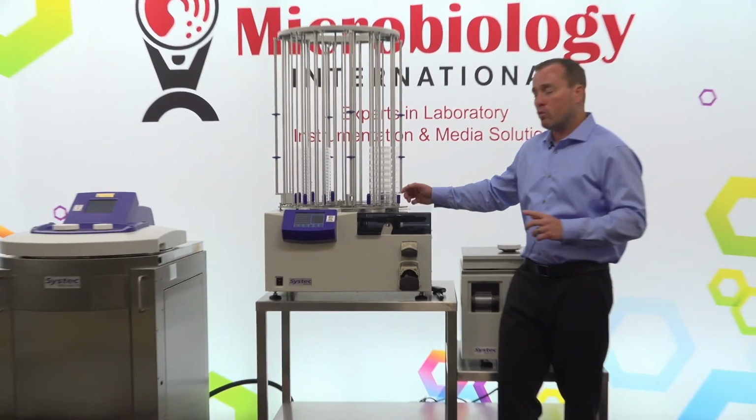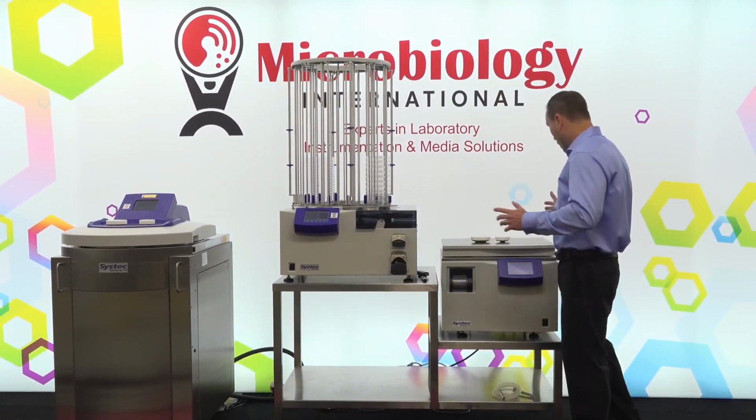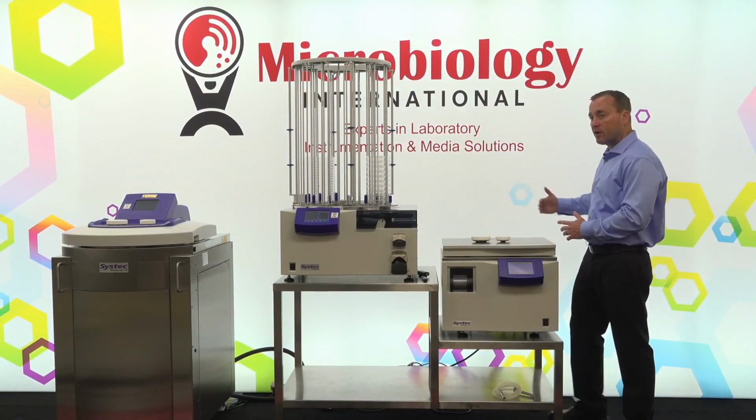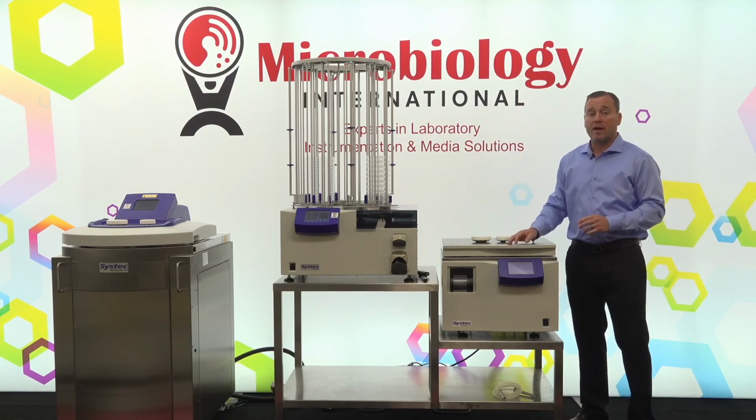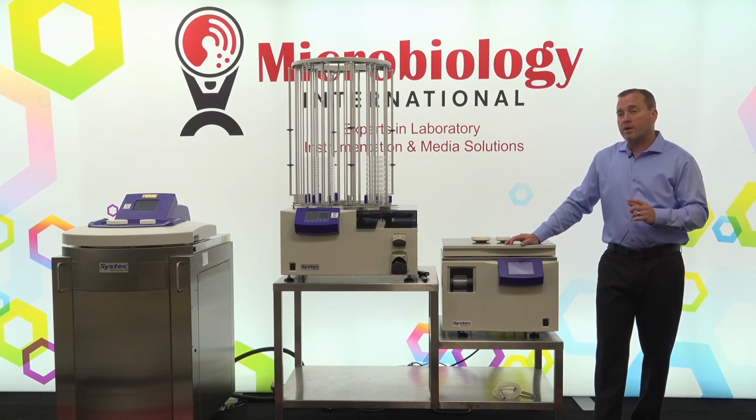And that Lynx printer would be attached. It could sit somewhere else on the bench. It has a fairly long umbilical. It would go to the back of the instrument and dispense onto those plates as they're being poured. We can fit up to 3 lines of 26 characters on the side of a standard plate.